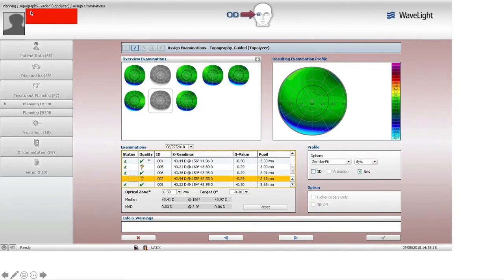So during this COVID outbreak, we've had a little extra time. We've done a lot of work at Forcities. There's actually one new, even more improved feature that I want to show you about the new Forcities surgical planning tool.